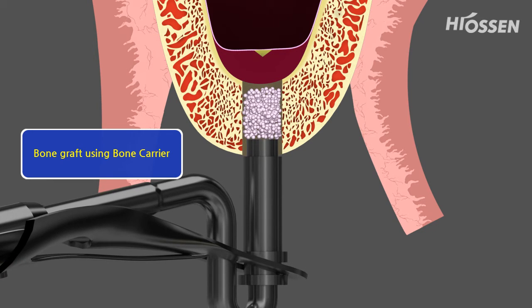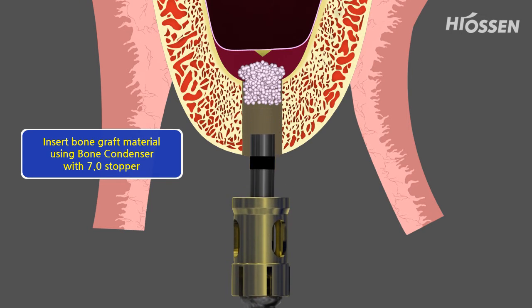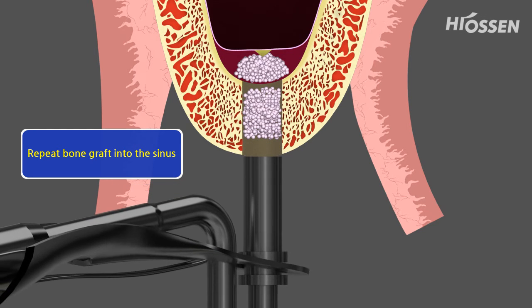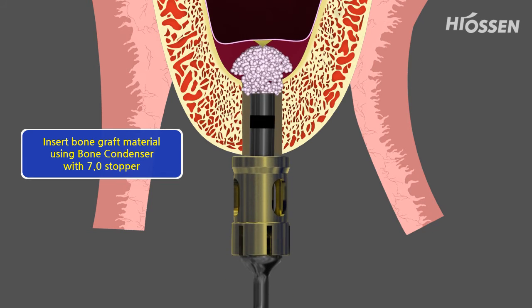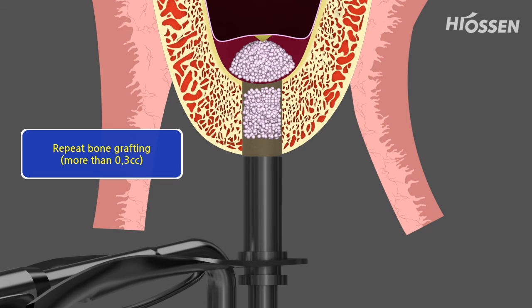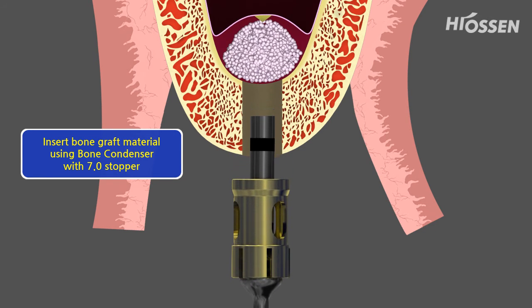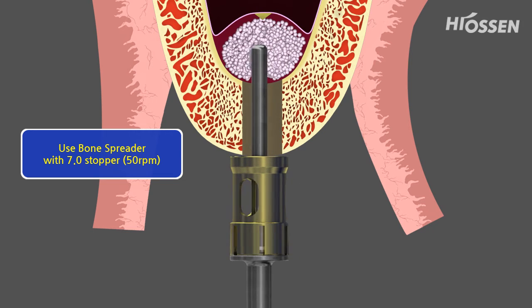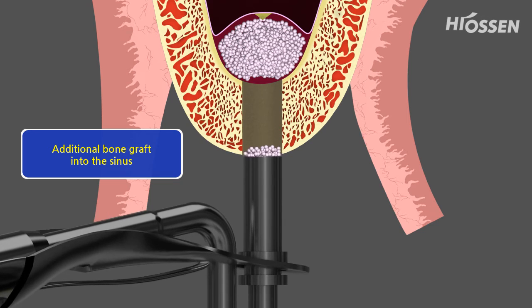The bone graft material is being filled into the sinus with the bone carrier. A 7 mm stopper is being connected to the bone condenser and the bone graft material is being pushed further into the sinus. The procedure has to be repeated until the cavity in the sinus is filled up. The bone graft material is being spread in the cavity by using the bone spreader with the 7 mm stopper at 50 RPM maximum.